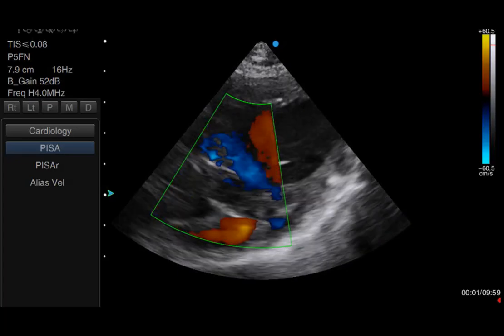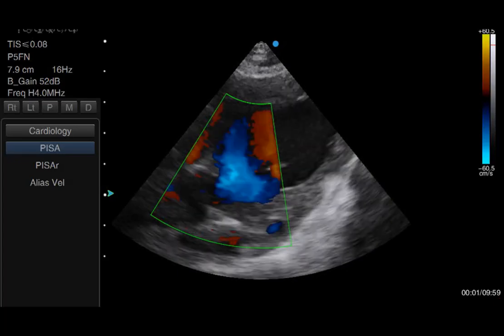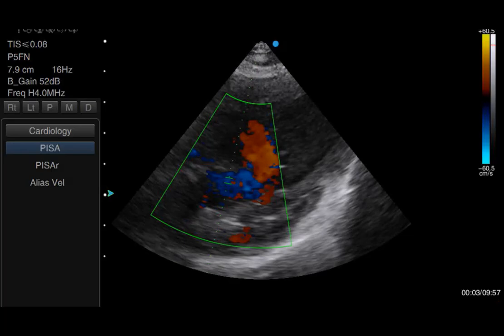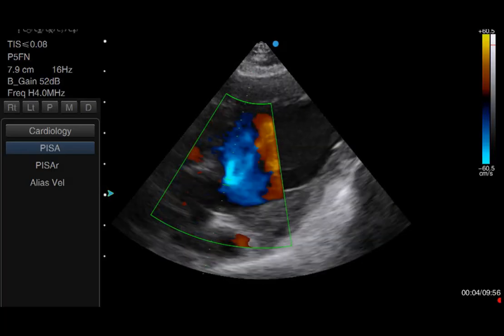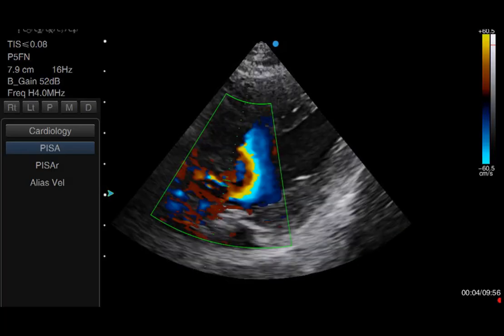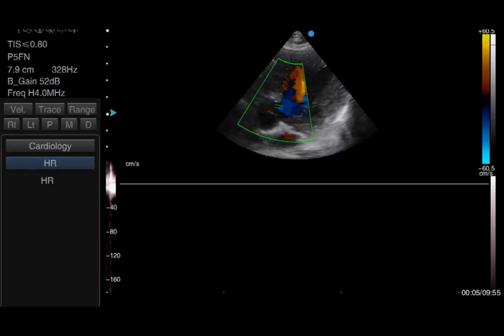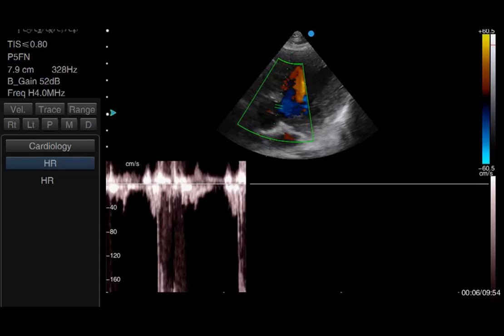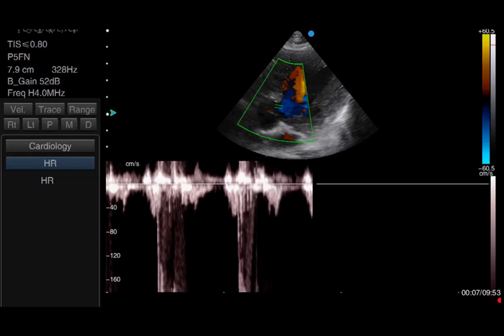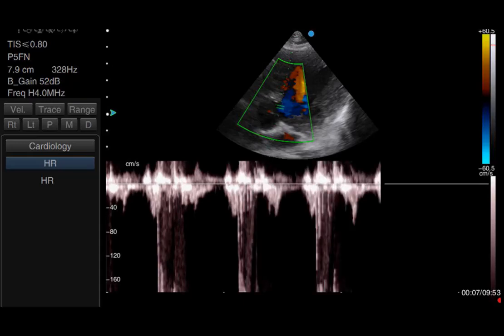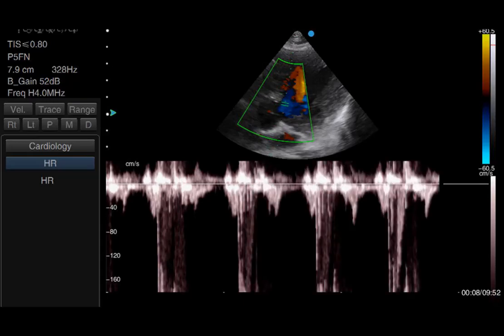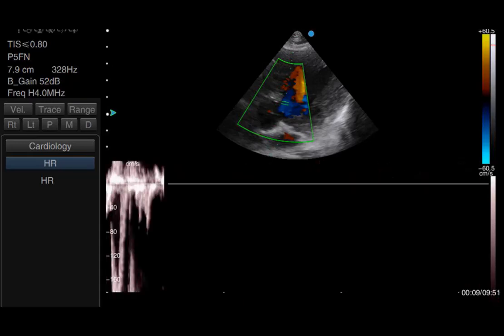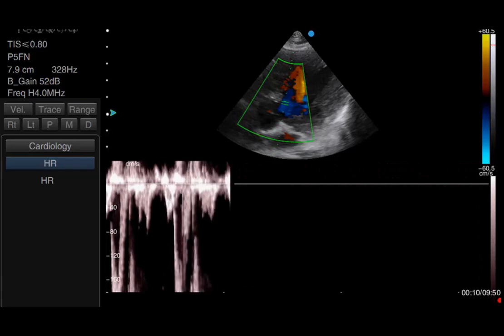Using the colour Doppler as a guide, I've positioned the pulse wave Doppler sample gate just before the aortic valve. You can see that the trace exceeds the limits of my Doppler scale — it's aliasing around, and the Doppler envelope is completely filled in because the flow is so turbulent.